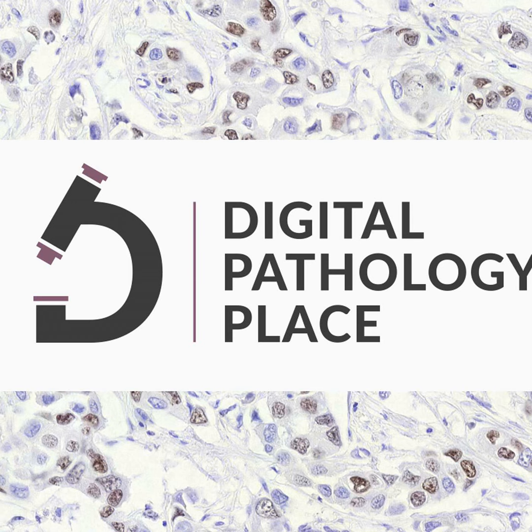Of course, there are tasks, for example, the lymph node metastasis detection, that you can solve for a large part locally. So you don't need a global context for many of the questions you can ask. But there's also other things. So you have the global context of the slide, but also patient information, things like age, history, outcome of blood-based tests, all that kind of stuff.